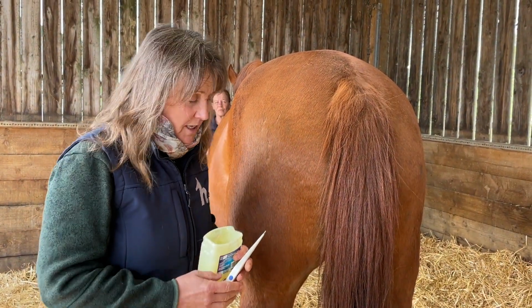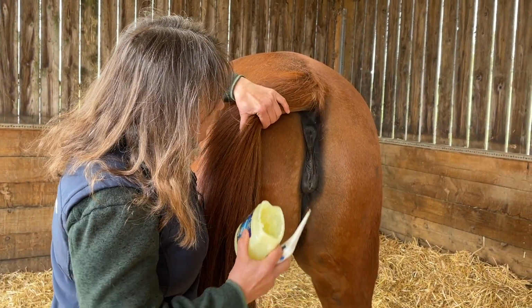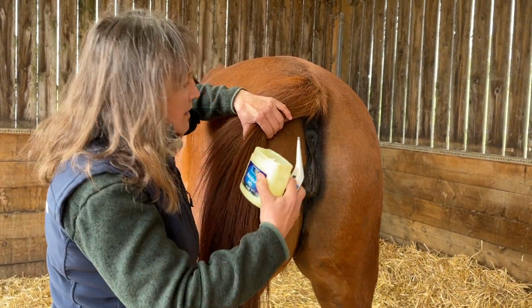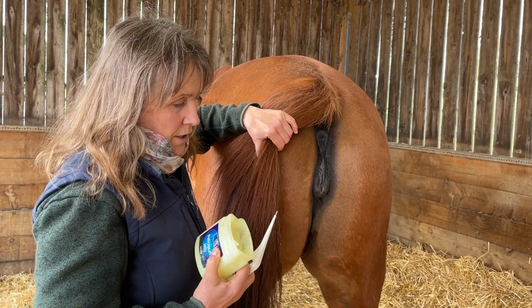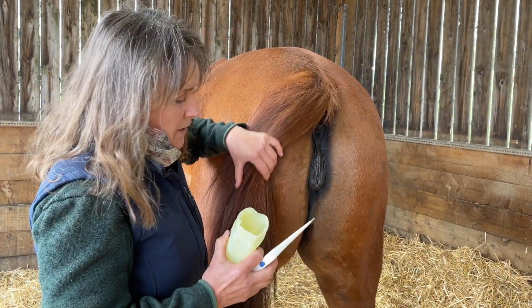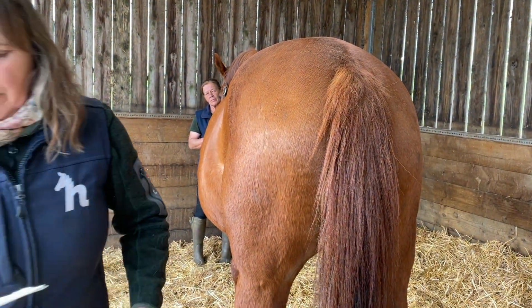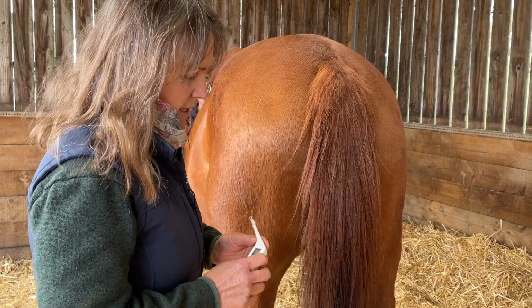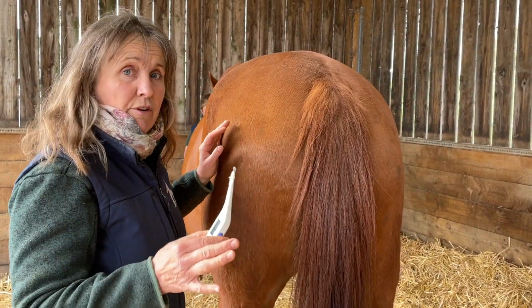Right, I'll carry on. So, we need to be inserting into the rectum, and as I say, running parallel or closely parallel to the ground. I will pop a little bit of lube on this, and the beauty of these magic devices, which they really are, there's nothing like digital these days, is that it does everything for you.